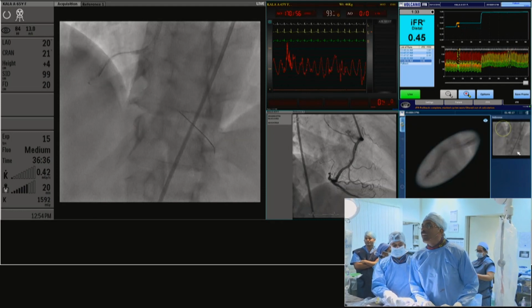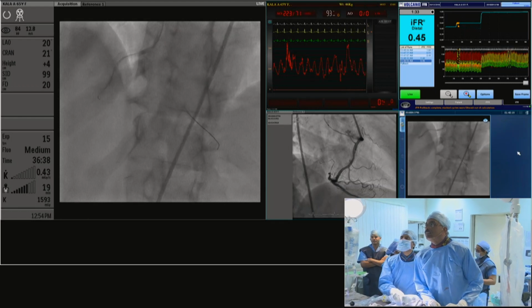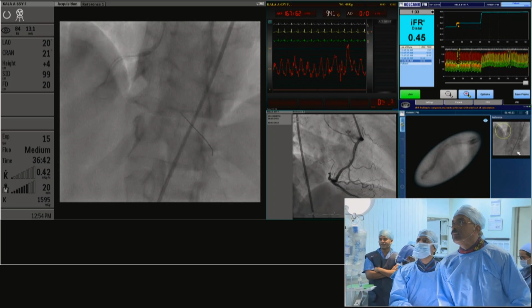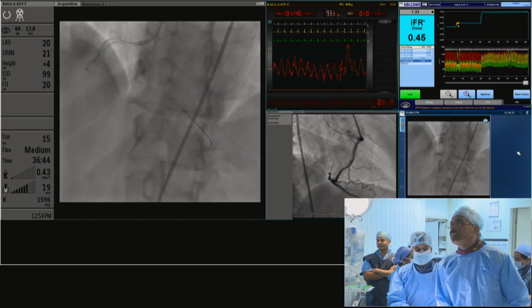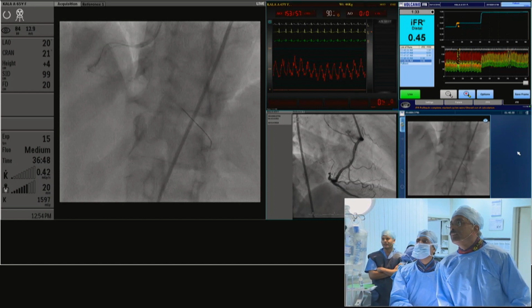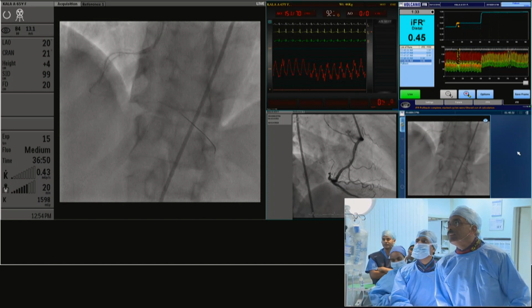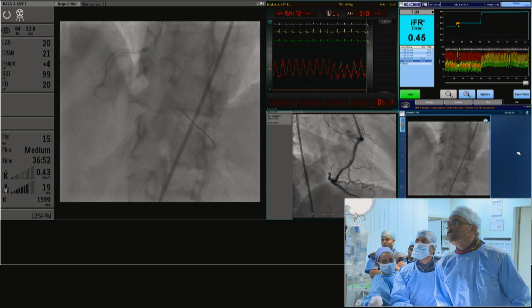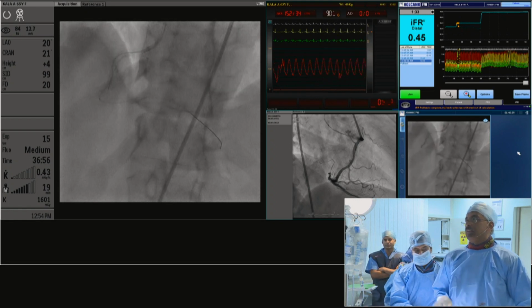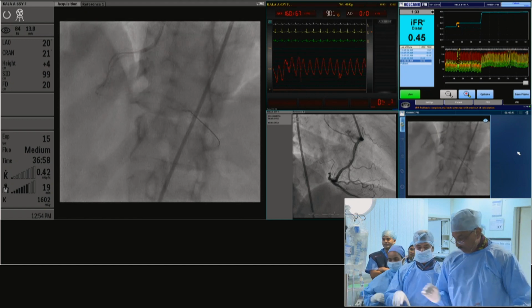We have to get our equipment to the lesion, and all of the suggestions in terms of a guideline are reasonable. This was particularly calcific and particularly tight, so I think you've got to take a pragmatic approach on how to treat the distal vessel. More often than not, I'll be honest with you, we don't have to treat the proximal vessel. This is just particularly tortuous.